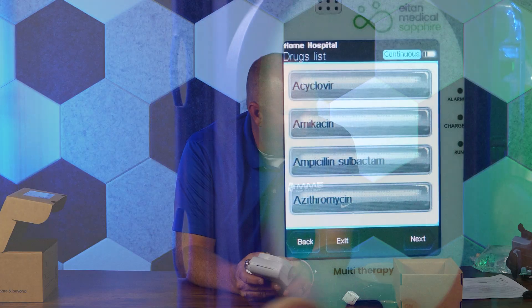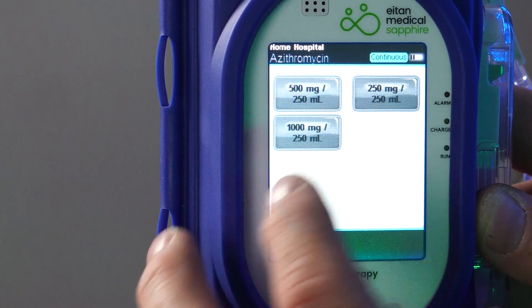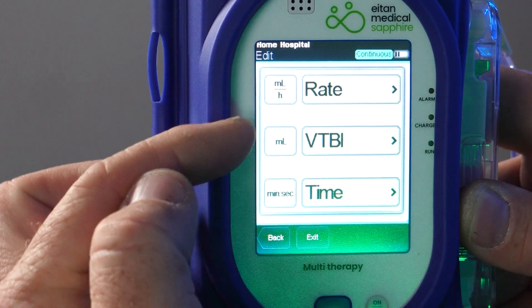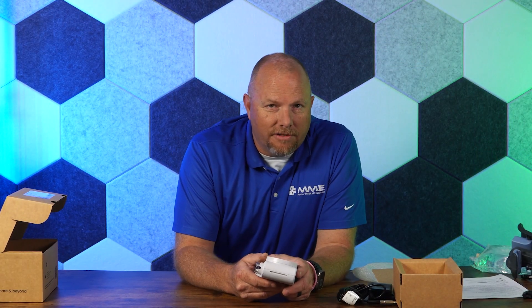The drug library inside the pump, which is maintained by the end user, is capable of holding up to 40 different clinical care areas. Within each of those, the pump can store up to 1,000 medications. The total capacity of the drug library is 8,000 medications, so it's very robust.